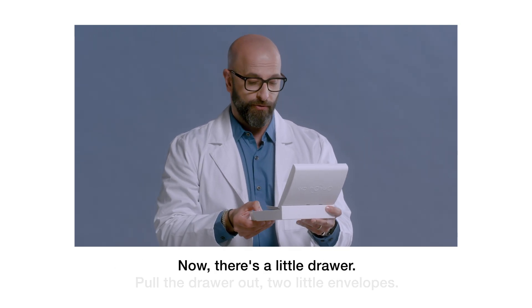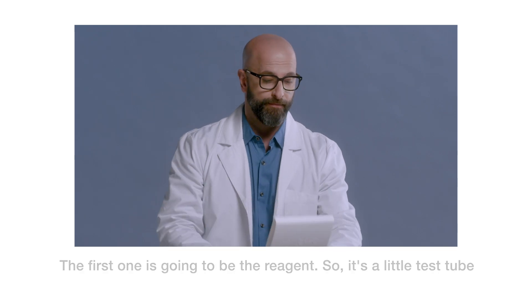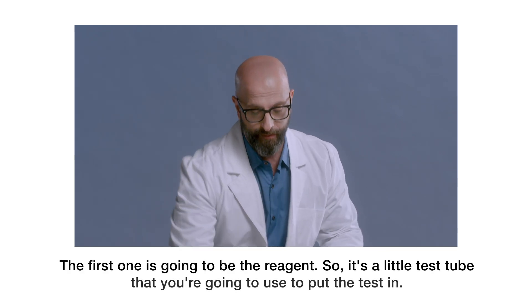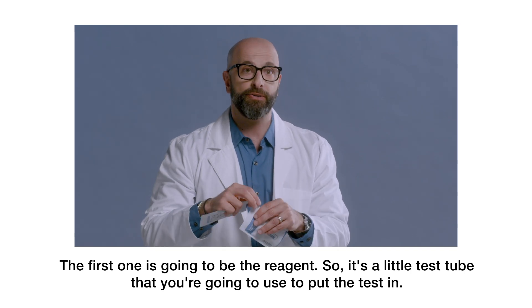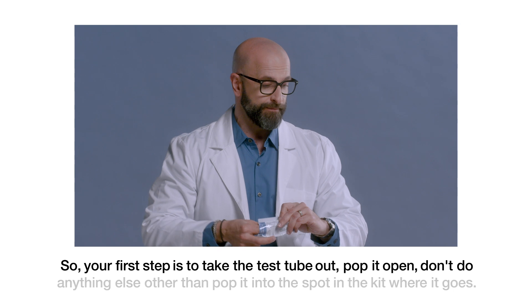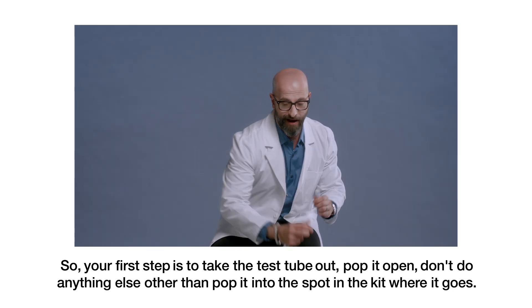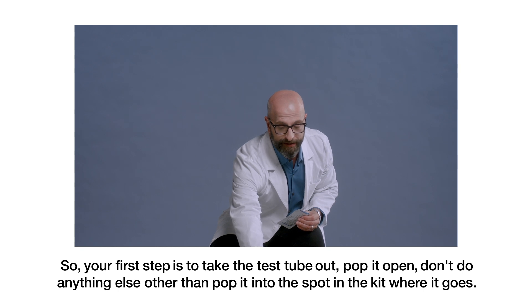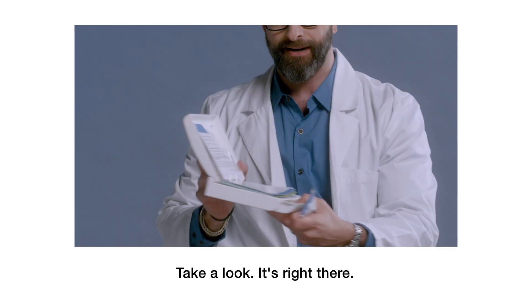Now there's a little drawer — pull the drawer out. Two little envelopes. The first one is going to be the reagent, a little test tube that you're going to use to put the test in. So your first step is to take the test tube out, pop it open, and don't do anything else other than pop it into the spot in the kit where it goes. It's right there.